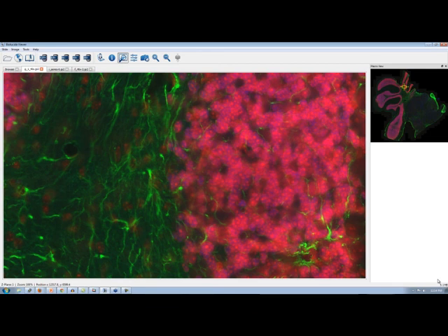About the data that streams down, I want to make another point: all of the data as it comes down is cached. So if you go to a region on an image, you download a portion of that data, and it is cached on the local system. If you come back, say, two weeks from now, and open the same image, if you go to the same regions, you'll have instant access to that data and nothing will be downloaded. Sure, it doesn't have to take any time downloading that again. Exactly. So that's navigating when you consider panning and zooming.